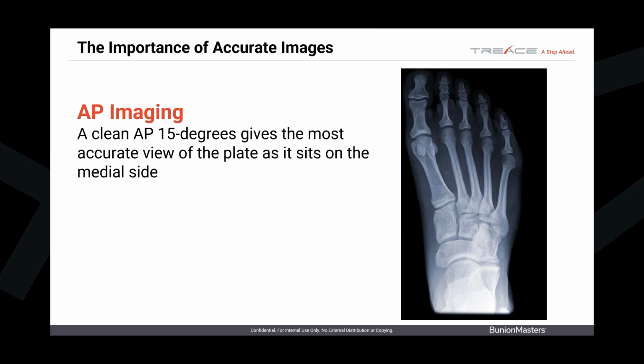We don't want to angle the plate dorsally or plantarly because it changes our trajectory. So X-rays are extremely important. You will need to get in the habit of taking them multiple times. Protect yourself, lead yourself appropriately, protect you and your family.